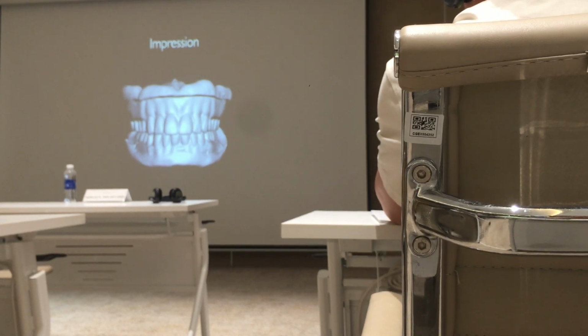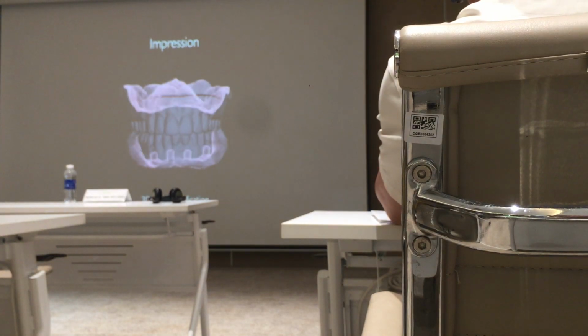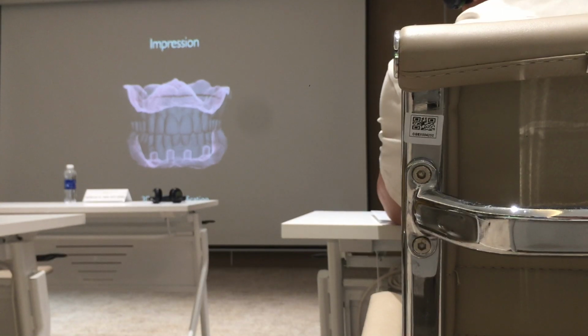And in this data, we do have information with the soft tissue. We do have the information about outer surfaces of the denture and also the interocclusal record. And we can do the 3D data modification so that we can move on with our final definitive zirconia prosthesis.